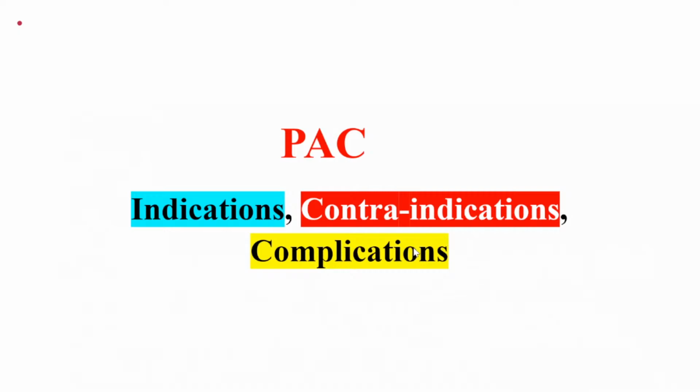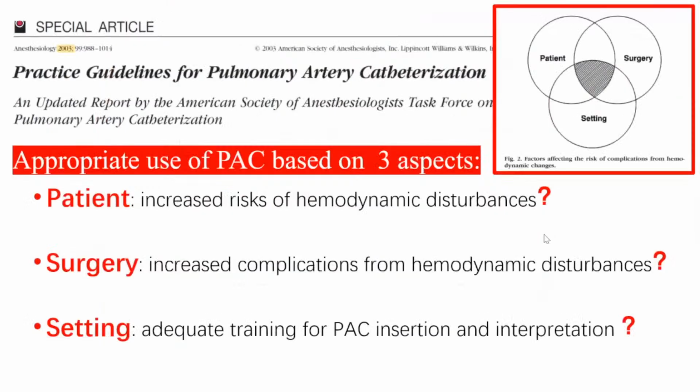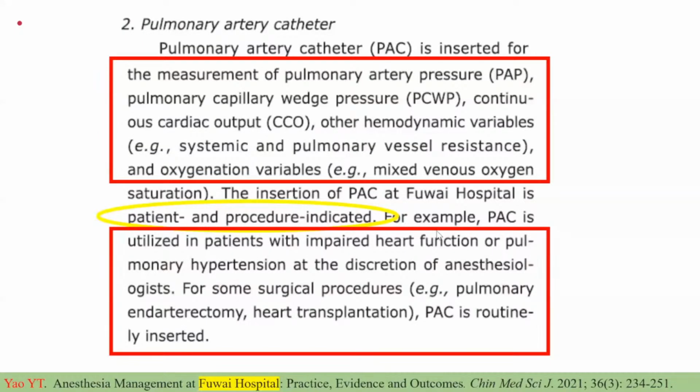Contraindications and complications. Different indications for PAC have been suggested, but routine use of PAC is not recommended. At Fuwai Hospital, the insertion of PAC is patient and procedure indicated. For example, PAC is utilized in patients with impaired heart function or pulmonary hypertension at the discretion of the anesthesiologist.